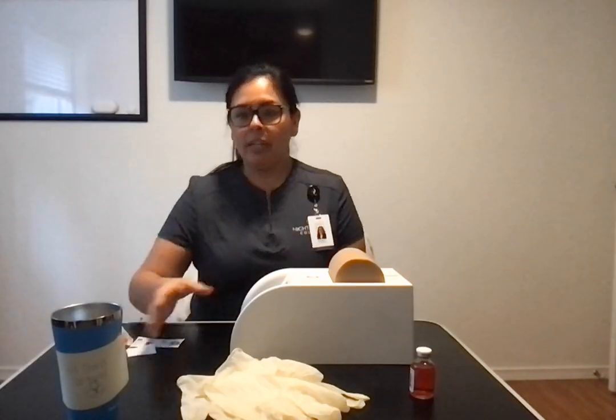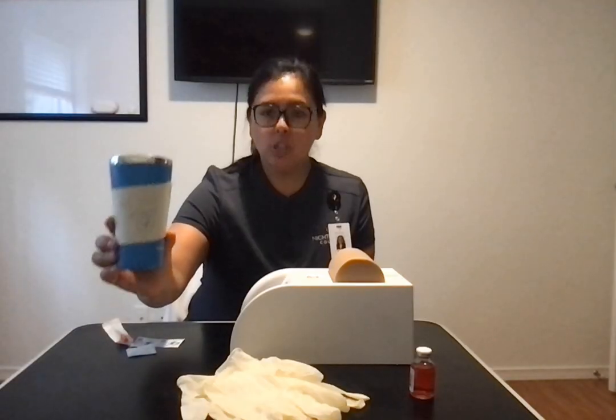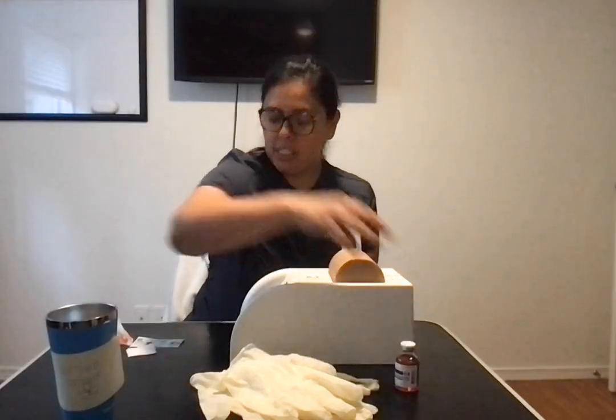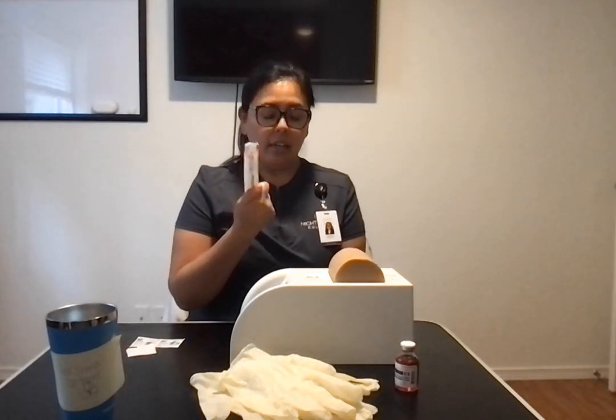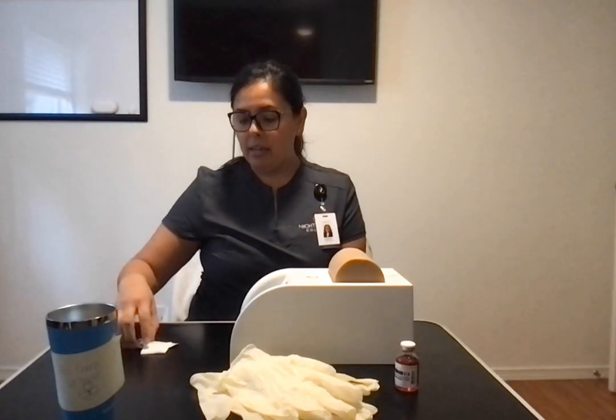For this video, we want to make sure I have all my supplies. I don't have a biohazard or a red sharps container, but this will act as my sharps container. I have my gloves, my medication, my syringe and needle, some gauze and my alcohol wipes, and I have my patient.